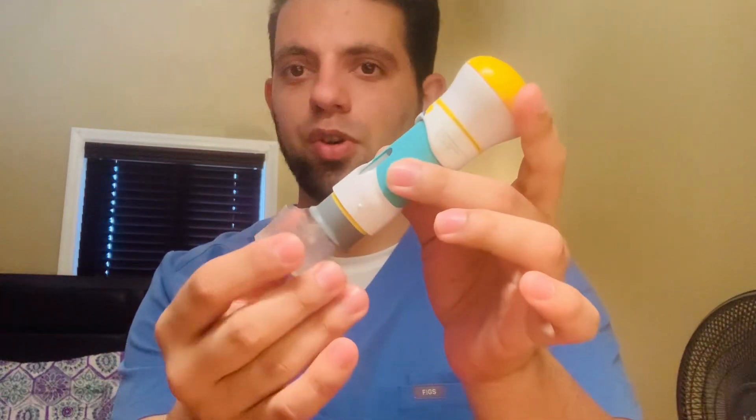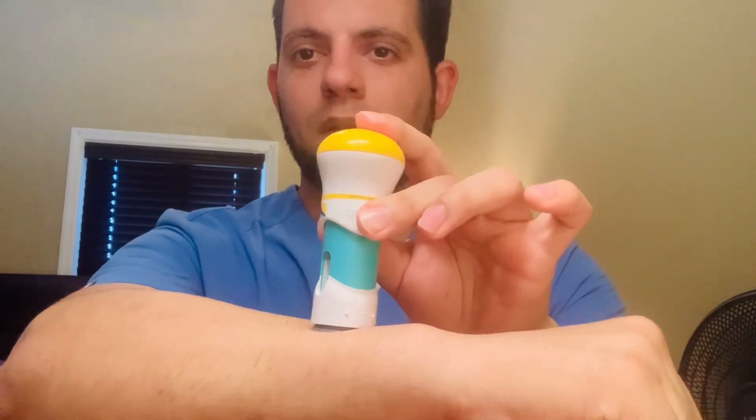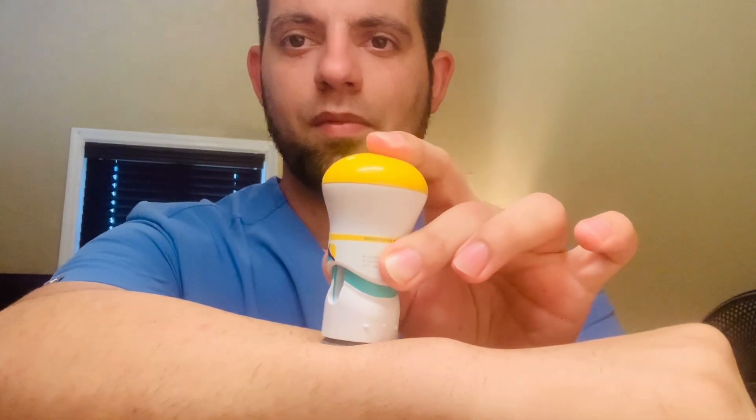The same process applies with the pen injector. You will take this one out, select either the abdomen or thigh, pinch the skin again, and press until you hear the click — one, two, three — you hit the click. Then you can pull back, and that's it. You have applied the medication properly.